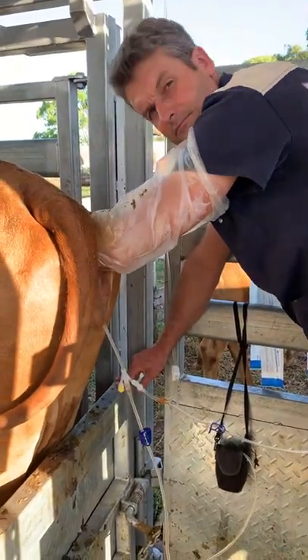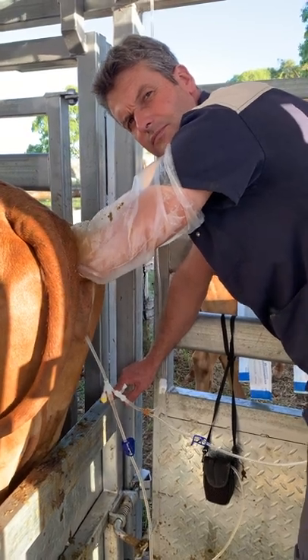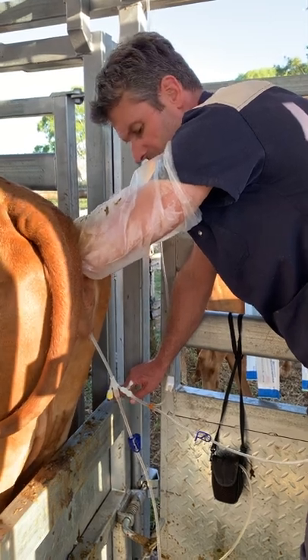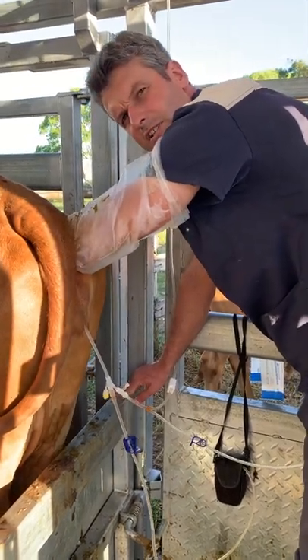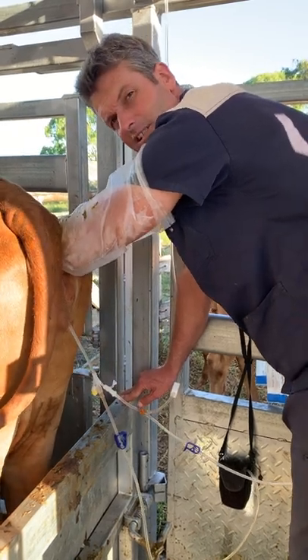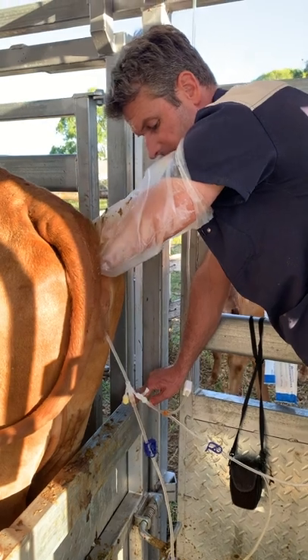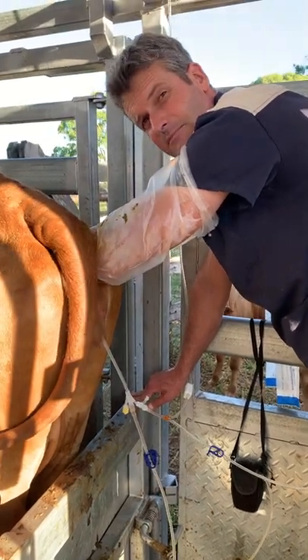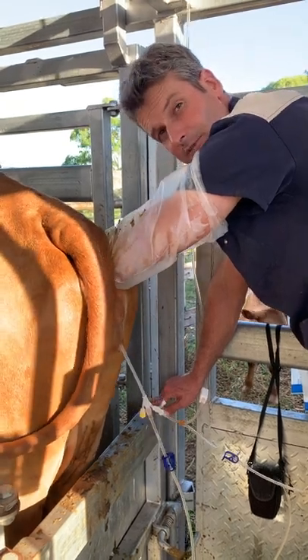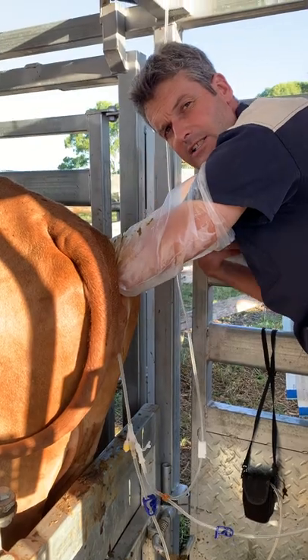That liquid you're putting in has got a bit of detergent-type water? Yeah, it's got a surfactant in there, so it's got a little bit of soapiness. But it's all tested and gentle and embryo-friendly, non-toxic. It's got saline as a base, protein in it, and a surfactant — basically just a little bit of soapiness to wash out and make sure all that mucus dissolves off the wall and comes out.